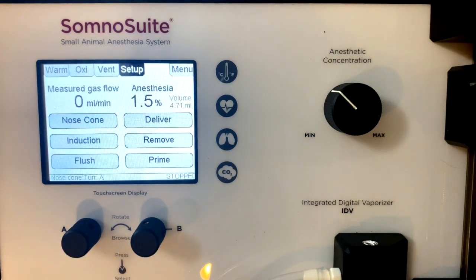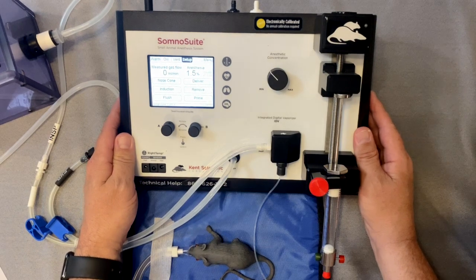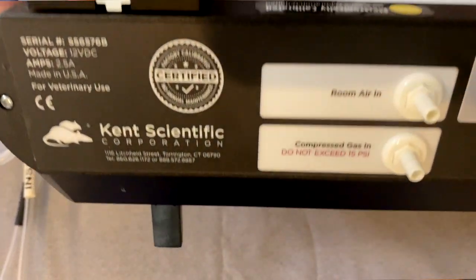If you'd like to use compressed gas, such as 100% oxygen or medical air, change the setting in the menu back to compressed gas and make the connection on the back of the unit.